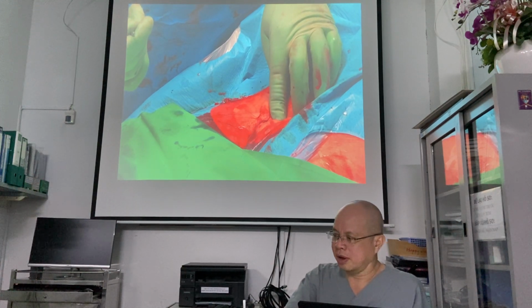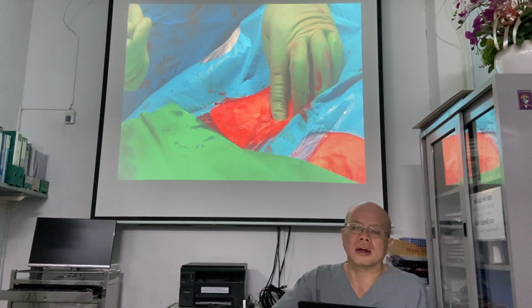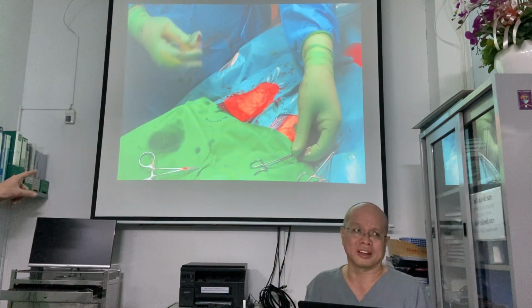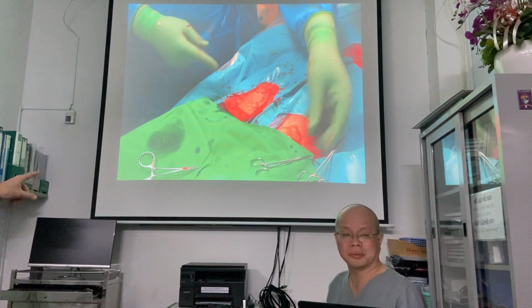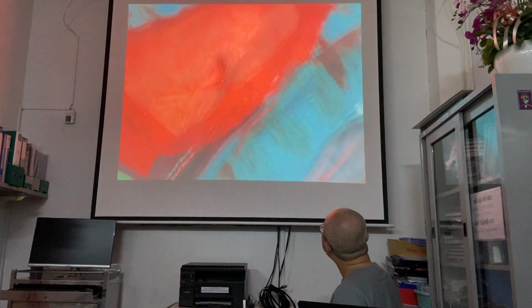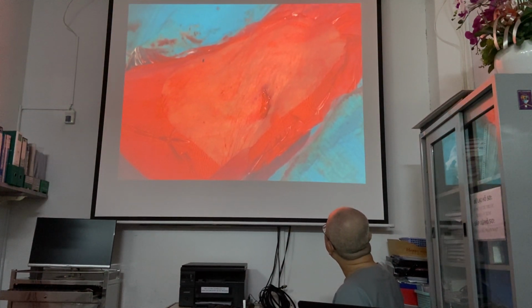This is the ProLite. Năm nay mình mua mấy trăm cái á, cho nên là if you want to do TAVI, you have to start with the closure device. You have to learn this. It will start again normally. It will start again. This is a TAVI case.